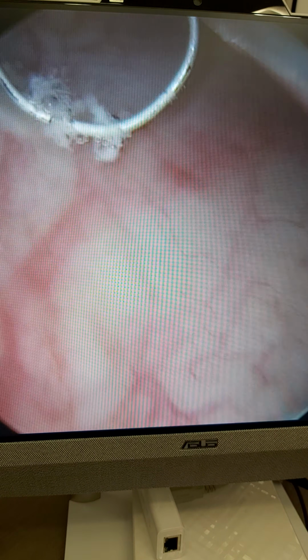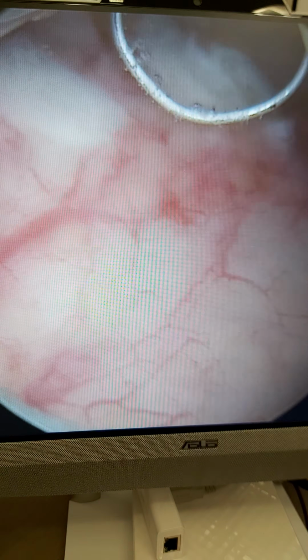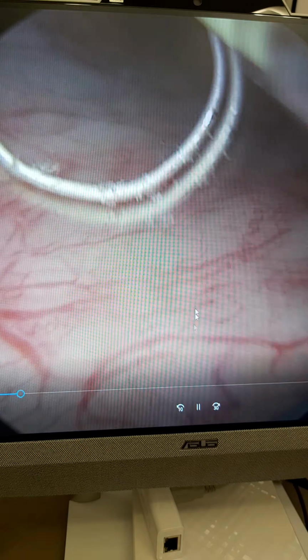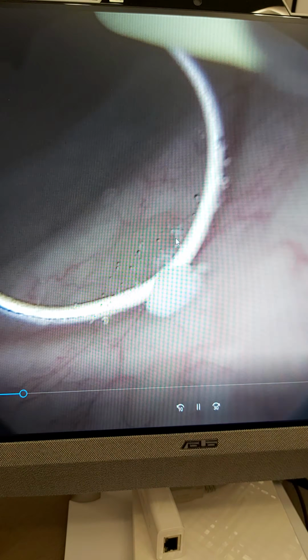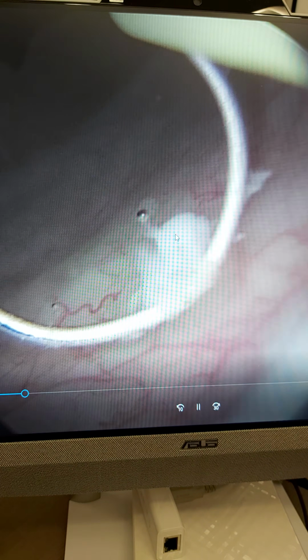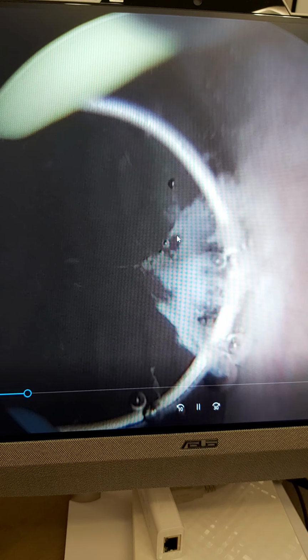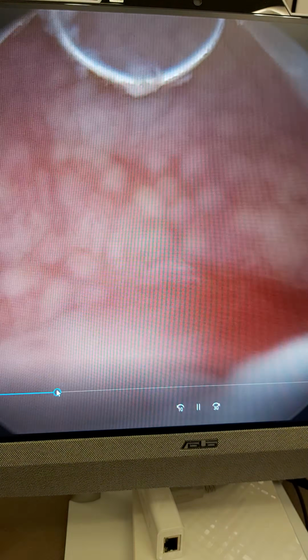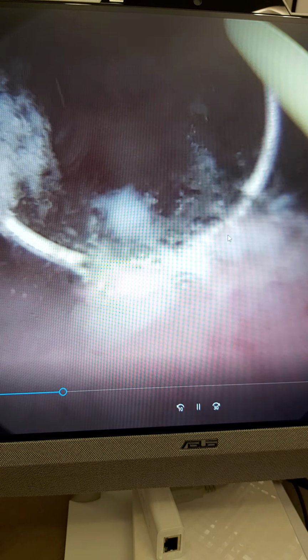We are marking the tissues. The fulguration site. In the trigone we can clearly see the abnormal changed tissues which become cystic, little spherical, round-shaped tissue changes. Here we see abundant little cysts in the bladder, and here the leukoplakias. We begin fulguration.